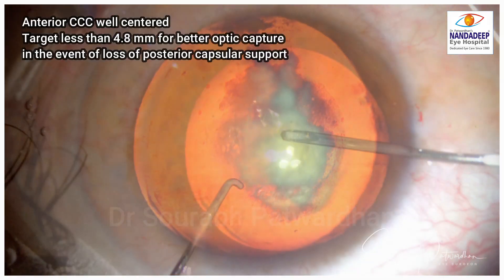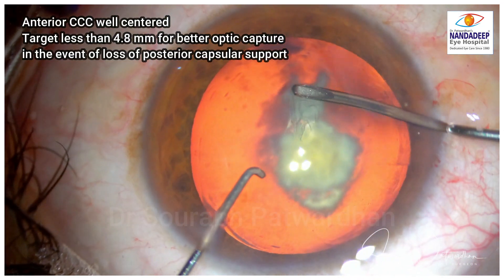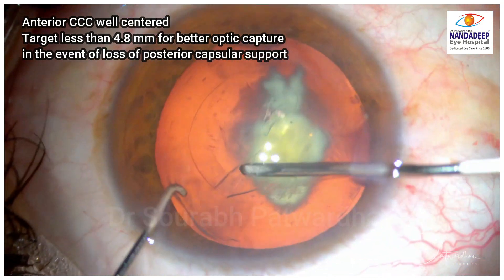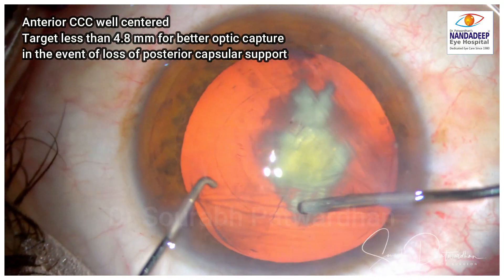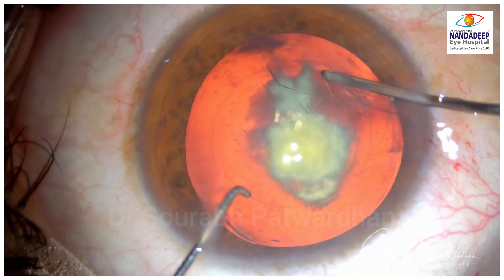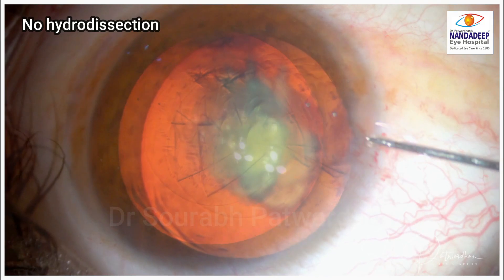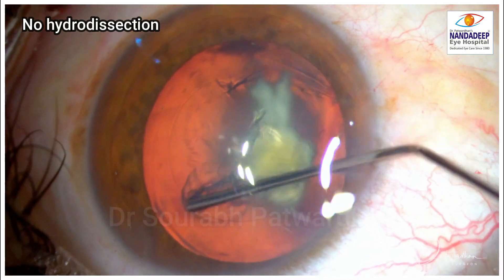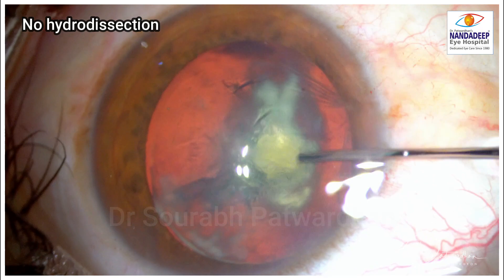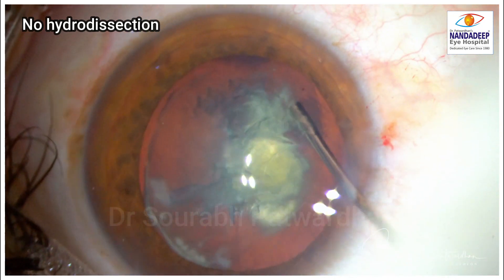The anterior CCC has to be well centered and targeted at a size of less than 4.8 mm to achieve best optic capture in the event of loss of posterior capsule. Another option is to do an oval rhexis. Only hydrodelineation is performed — no hydrodissection — because if there is a pre-existing breach in the posterior capsule, it may open up with forceful hydrodissection.